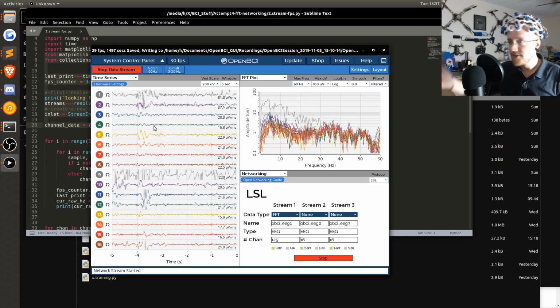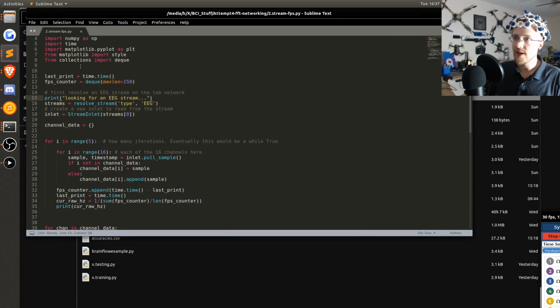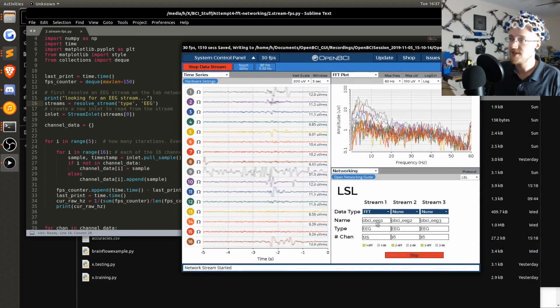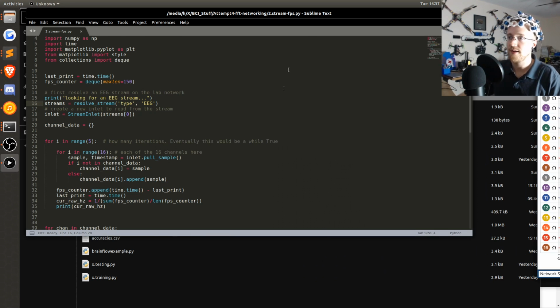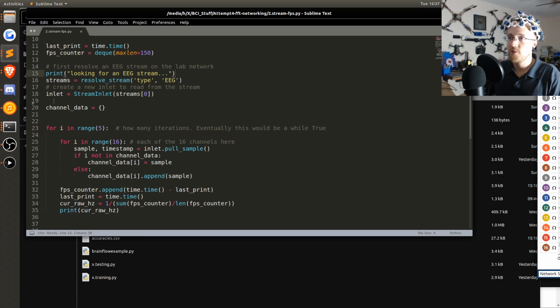So right now, this is just streaming out this information, and then in the code, we just collect that information. So we're just saying, hey, give us the stream that's of type EEG. You could either do it that way, or you could grab it specifically by name, which is pretty cool. Like I said, I've never used PyLSL, and I'm guessing most of you probably haven't either. So cool, and then we can grab that specific stream. It'll be the only one in this case because we're not streaming anything else on the other channels, but you could stream the other things as well.